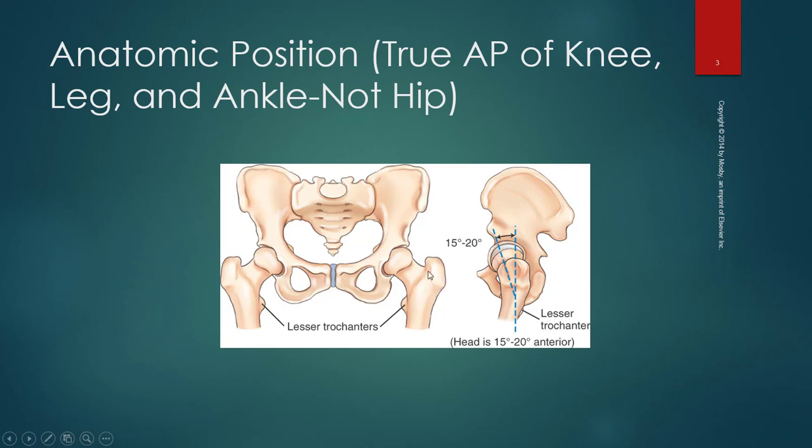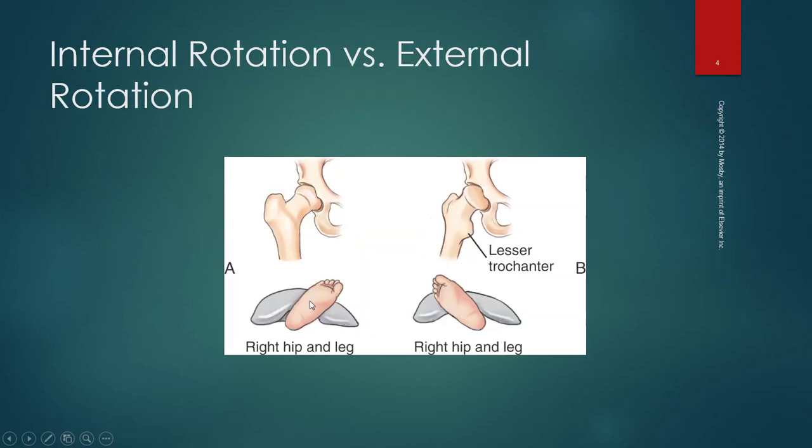Remember how I told you about the angle of that hip sitting back, the greater trochanter? It's really important to roll the toes so that they're touching, so you're going to make a TP out of the toes when you're doing the pelvis or the hips. What this does is it pulls this angle from a 20 degree angle and pulls that greater trochanter so that it's in profile. So here you can see when we take that right leg and we turn those toes in, it positions that greater trochanter so that we're able to visualize it.